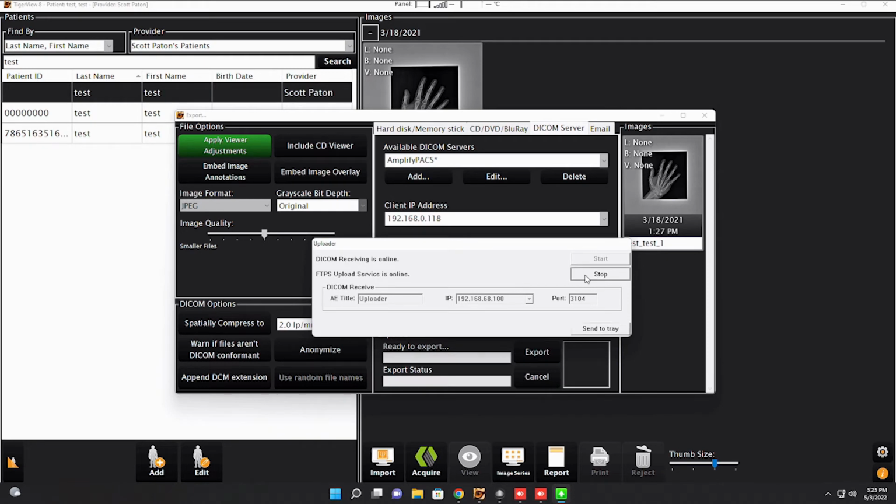So what we're going to do is click Stop, and from the pull-down menu we will select it. Now if you don't see the IP address listed here, that means that you have to restart your computer, so we're going to do that.